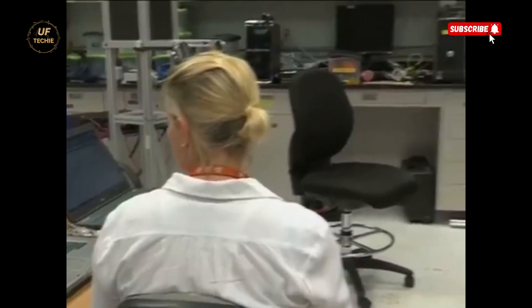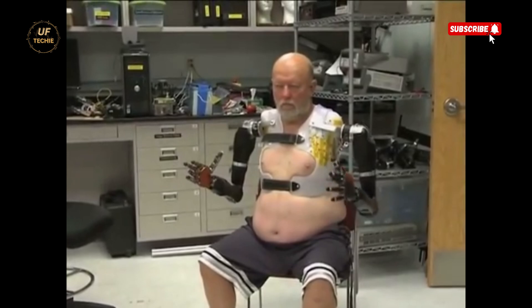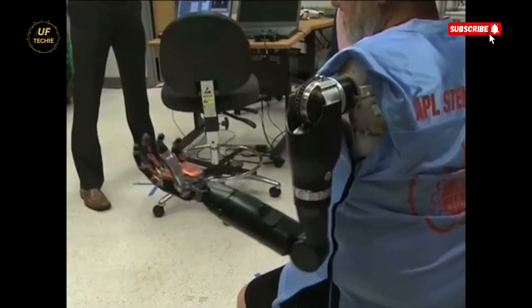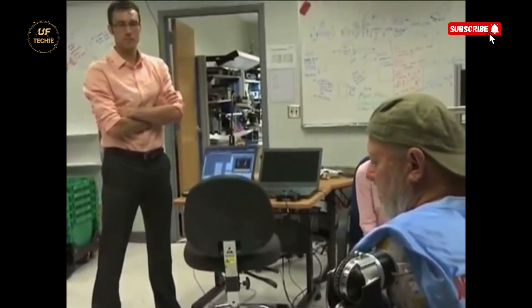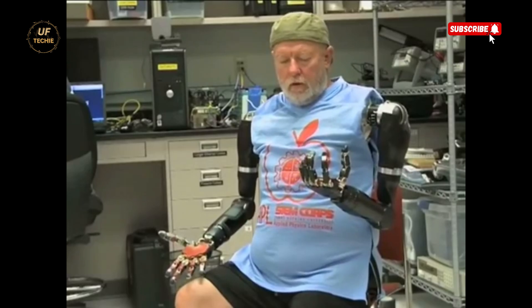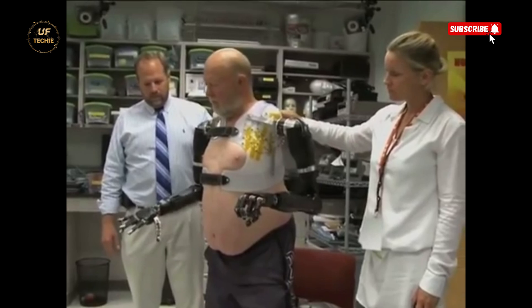Leslie Baugh lost both of his arms in an electrical accident over 40 years ago. For decades, he lived without the full function of his limbs, until he became part of a revolutionary program at the Johns Hopkins University Applied Physics Laboratory. There, Leslie became the world's first amputee to have mind-controlled prosthetic limbs attached directly to his body. After a series of intensive training sessions, he was able to control the limbs with nothing but his brain signals, essentially turning himself into the computer that moves the robotic arms.